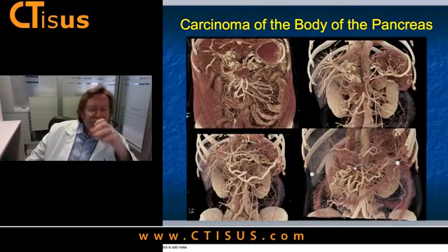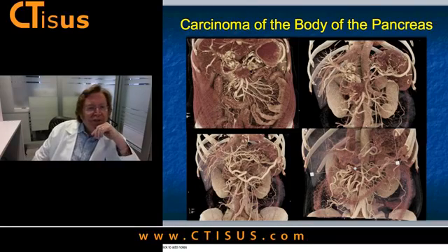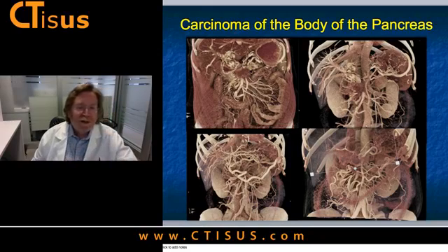There was an article written about this about 3 or 4 years ago, as GPUs came along from NVIDIA to be able to do this kind of lighting model. And Siemens, Robert Schneider at Siemens particularly, has been able to implement that into a product, and we've had the privilege of working with them on some of the new product.